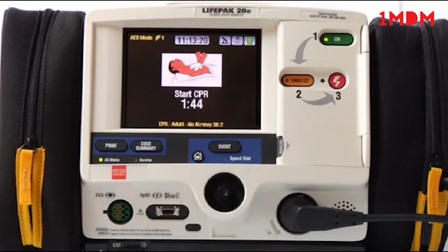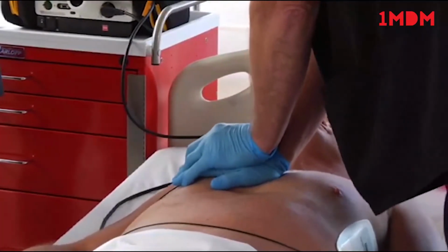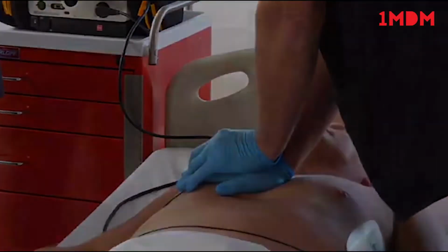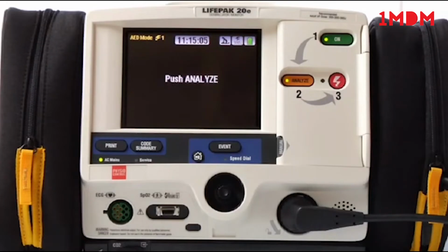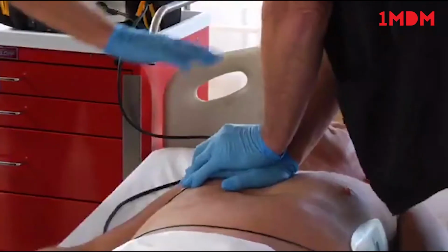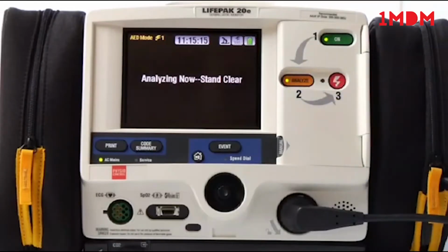Start CPR. A CPR timer will count down. The CPR metronome helps you time compressions and ventilations. Remember to do compressions hard and fast according to current recommendations. At the end of CPR time, the AED prompts for another analysis. Push Analyze. Continue to follow screen messages and voice prompts until the code team arrives.